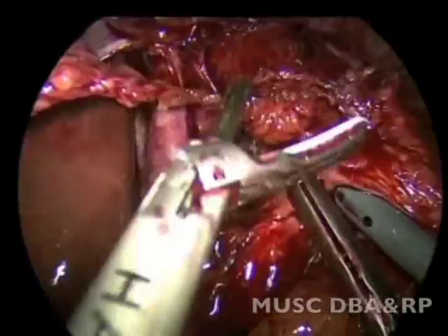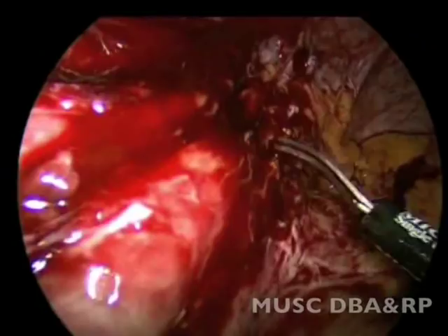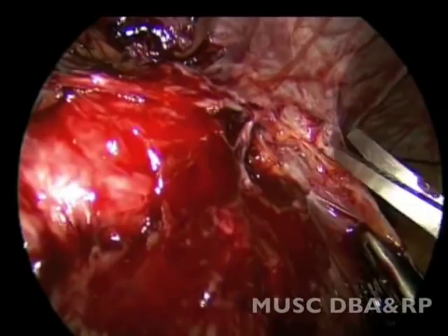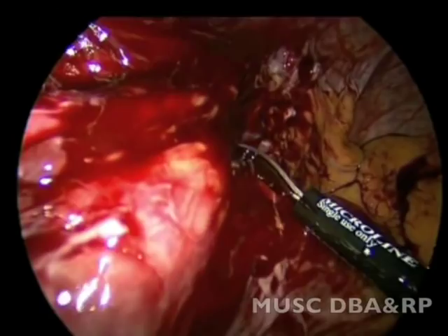The wrap was then dissected away from the left crus of the diaphragm using electrocautery and sharp dissection.